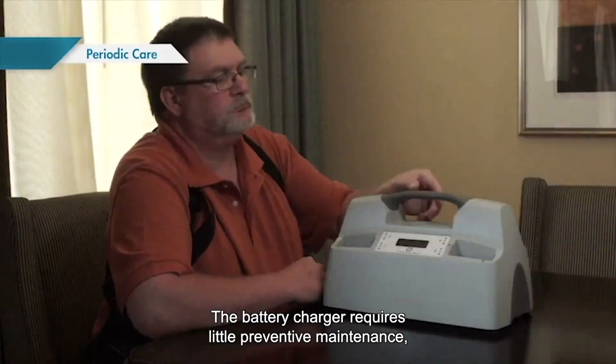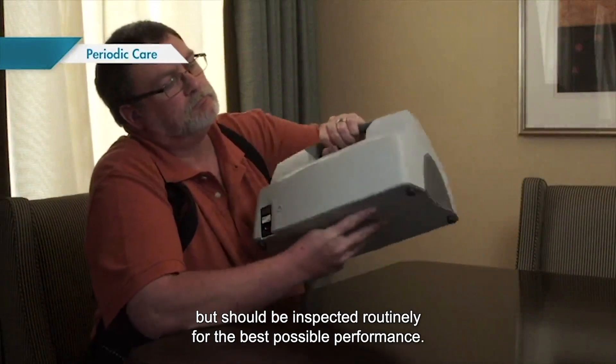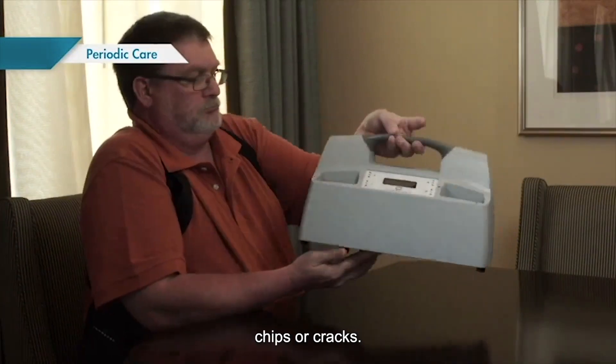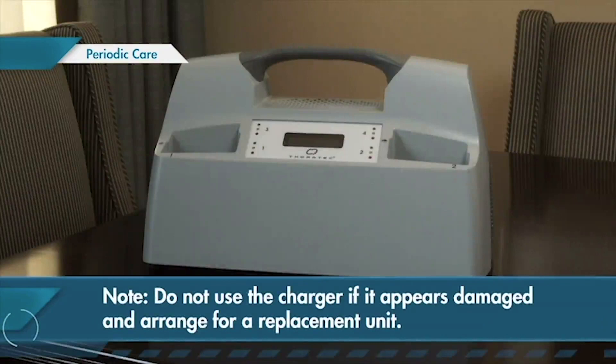The battery charger requires little preventive maintenance but should be inspected routinely for the best possible performance. Check for signs of physical damage once a week, such as dents, chips, or cracks. Do not use the charger if it appears damaged and arrange for a replacement unit.